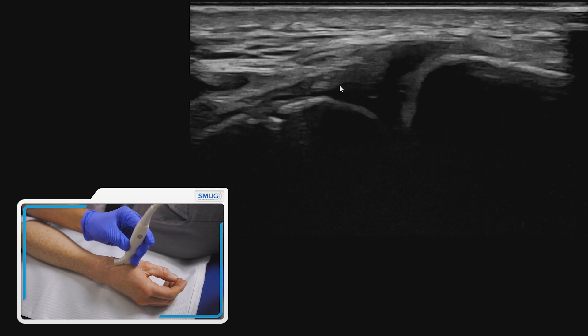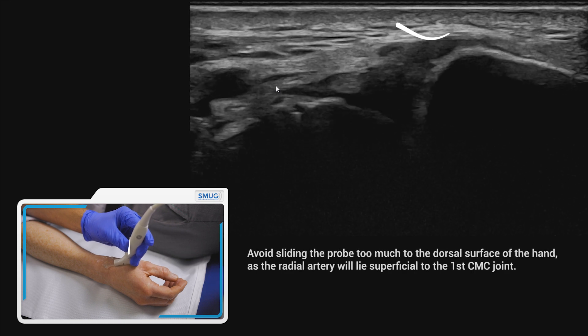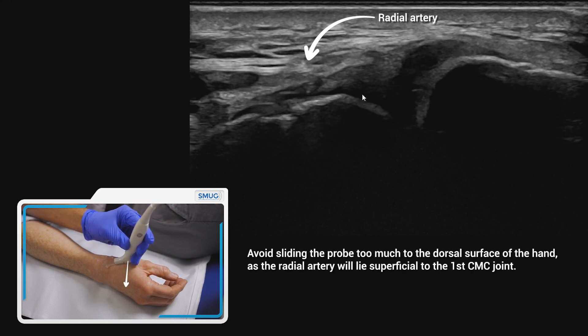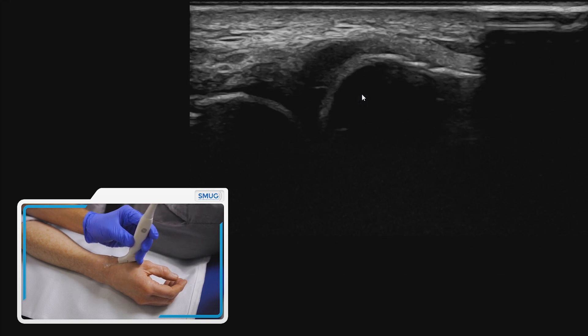It's important that you don't go too far around, as the radial artery comes on top of the joint, which you can see there. So don't go too much onto the dorsal aspect — stay around here.